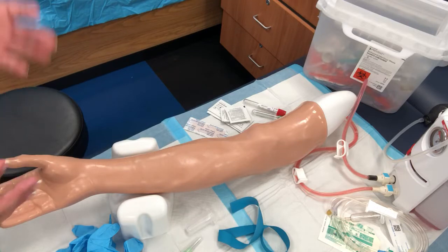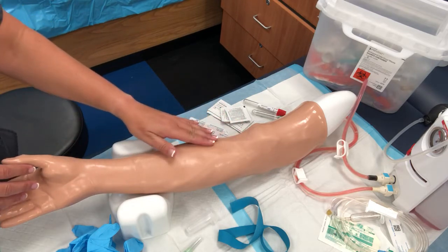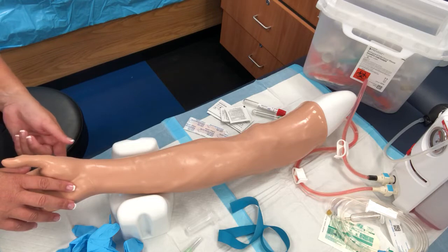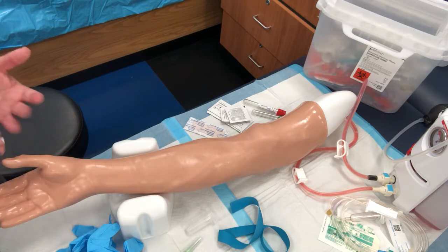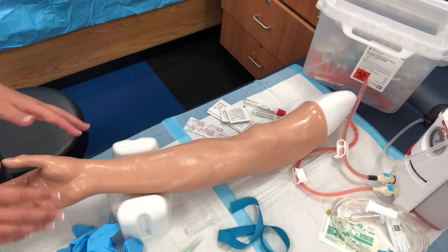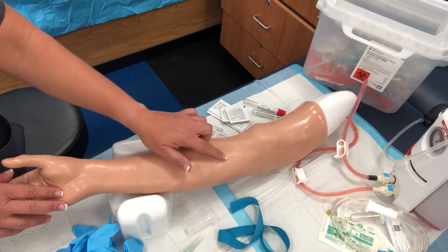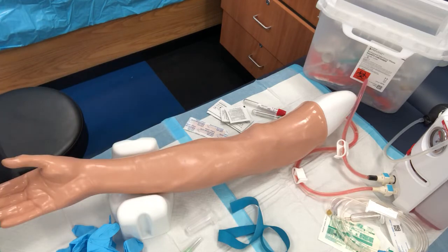So once you have essentially introduced yourself to your patient, identify that they're there for blood, even prior to cleansing this off with alcohol, it's okay to just go through and palpate in the antecubital fossa. Even on these models, you can palpate down into the hand, so you'd be going on the extensor surface of the hand. Certainly we don't go on the palmar surface. Really what you're looking for, either with venipuncture or with IV placement, is where are you anatomically away from nerve and more important structures that could be injured if the procedure was not done correctly. So most people will palpate and get a sense of where they want to go and maybe one landmark, if not a backup landmark, even prior to prepping their patient.